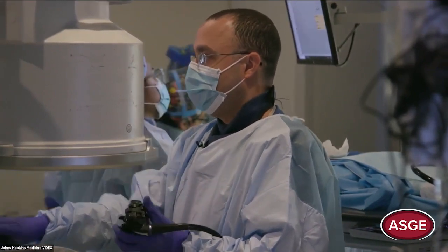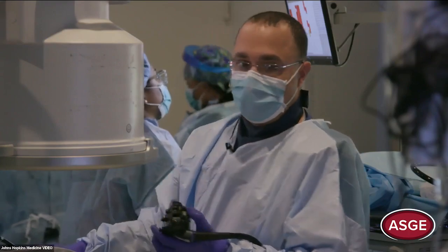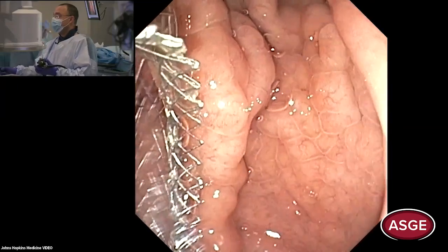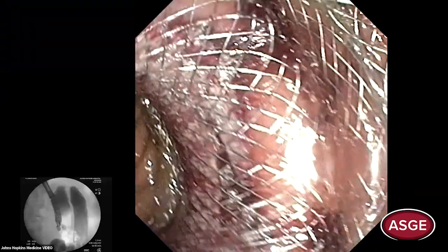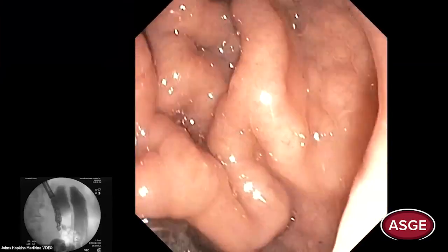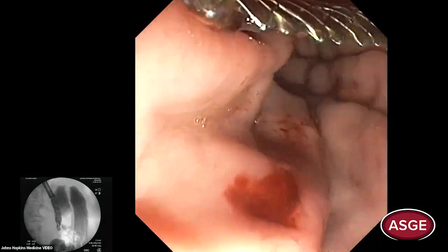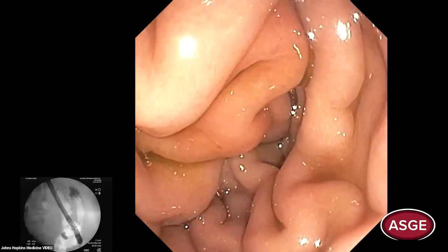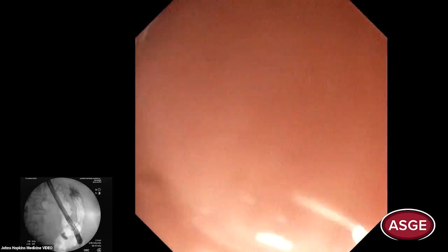Now entering the AXIOS — we relate going through the stent as if it's a pylorus, so you want to aim to the top. We go in. We have to be careful because there looks like there's an angle here, but we're able to pass. Fluoroscopic guidance can be helpful in this situation — if you feel the stent is moving with you, you have to stop.